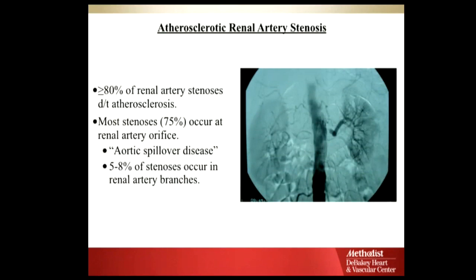So what over here? What do you guys think? Absent right kidney? To which kidney? To the right. You're right. It's filling. You can see it. I think that's a shadow for the right kidney. But you're right. It looks like it's out, and there's a high grade on the left, right?